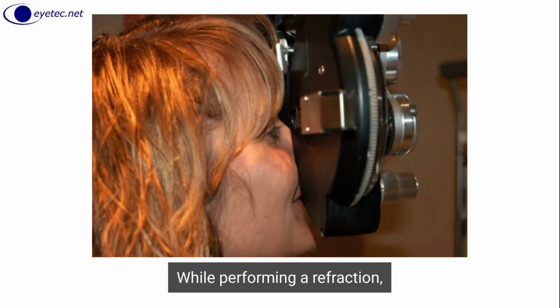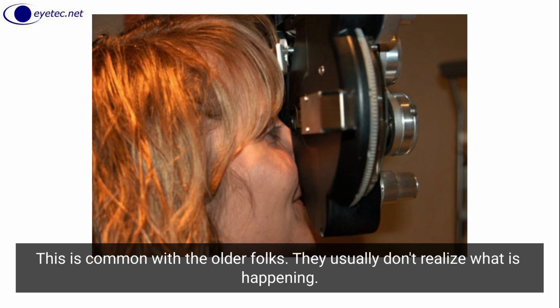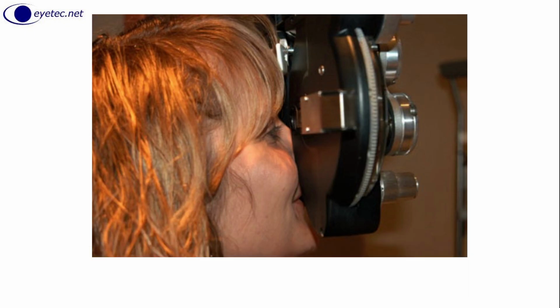While performing a refraction, periodically check that your patient has not been sinking down under the phoropter. This is common with the older folks. They usually don't realize what is happening. A minute ago they were seeing 20/30 and now they can't see anything. Encouraging the patient to sit up straight usually gets them aligned properly.